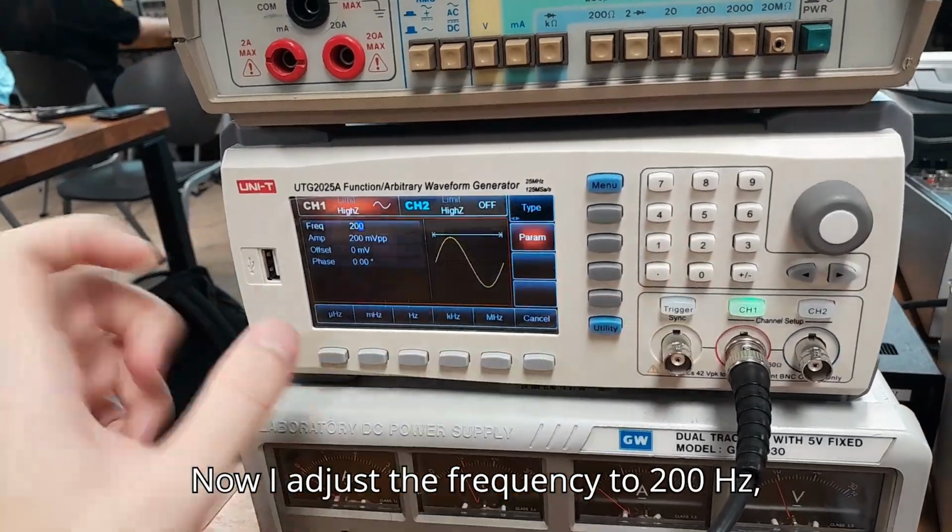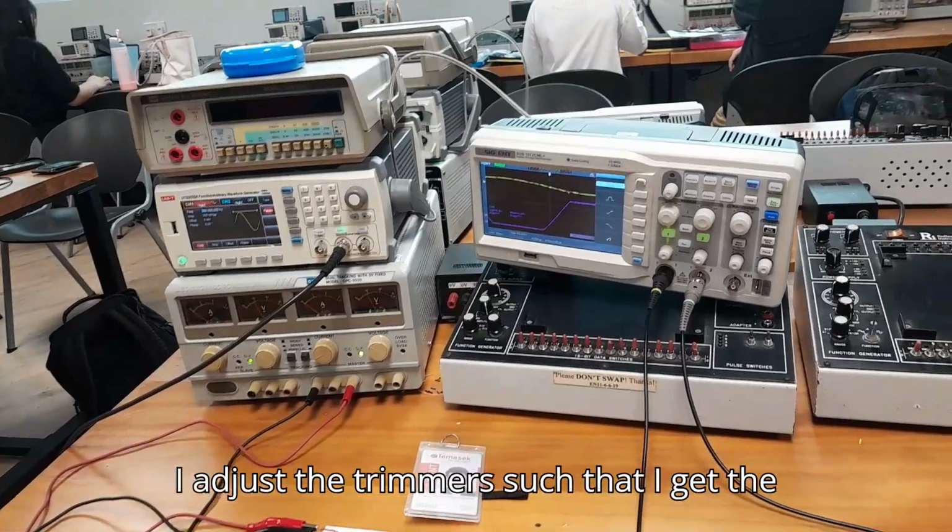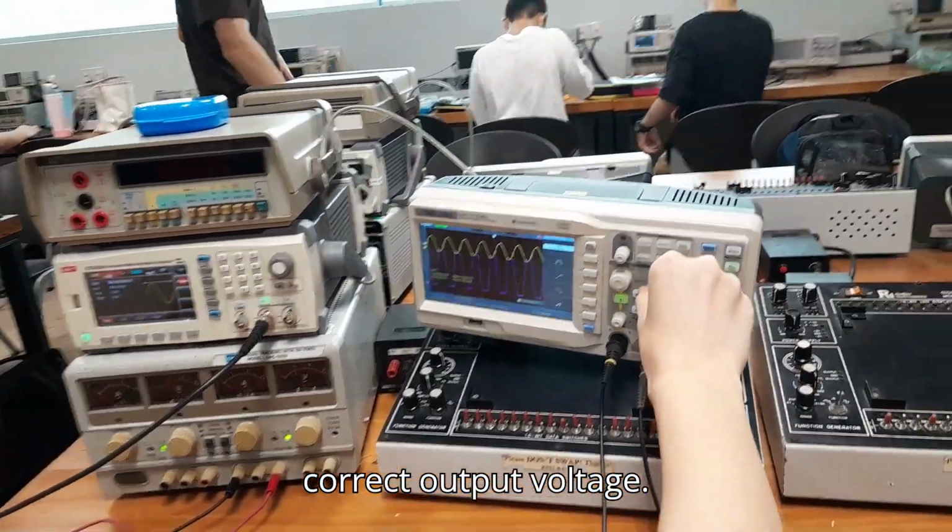Now, I adjust the frequency to 200 Hz, but I keep the amplitude, and same thing, I adjust the trimmers such that I get the correct output voltage.